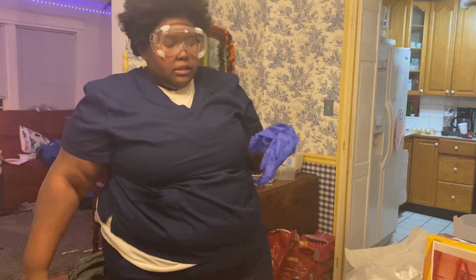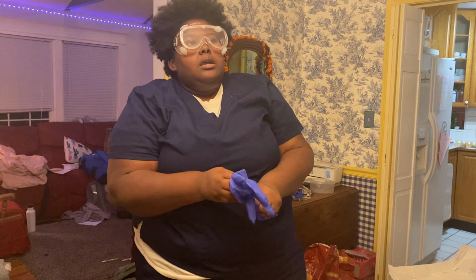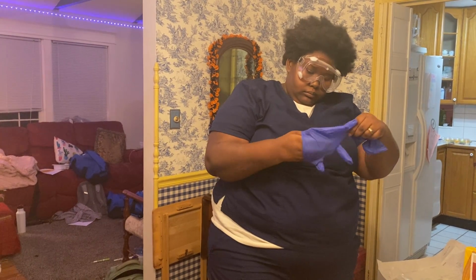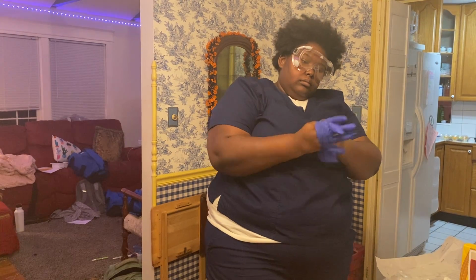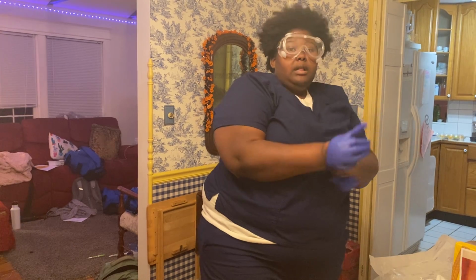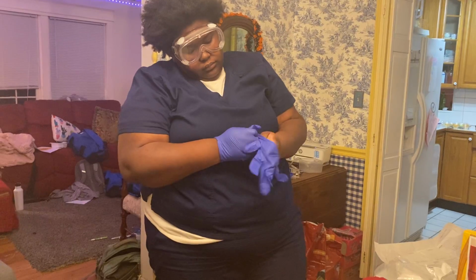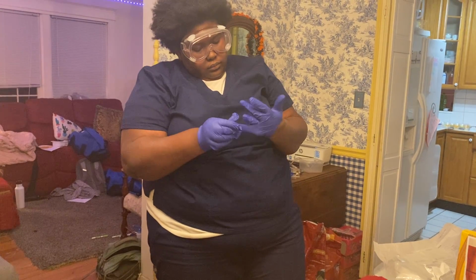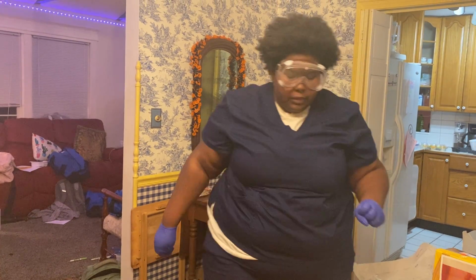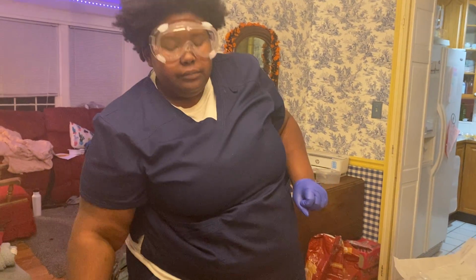Then for discontinuing, I would put gloves back on. And then I will check the catheter.